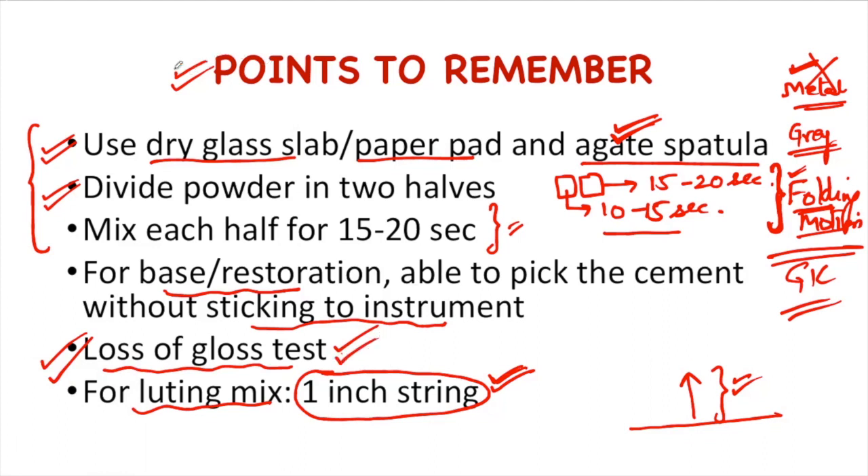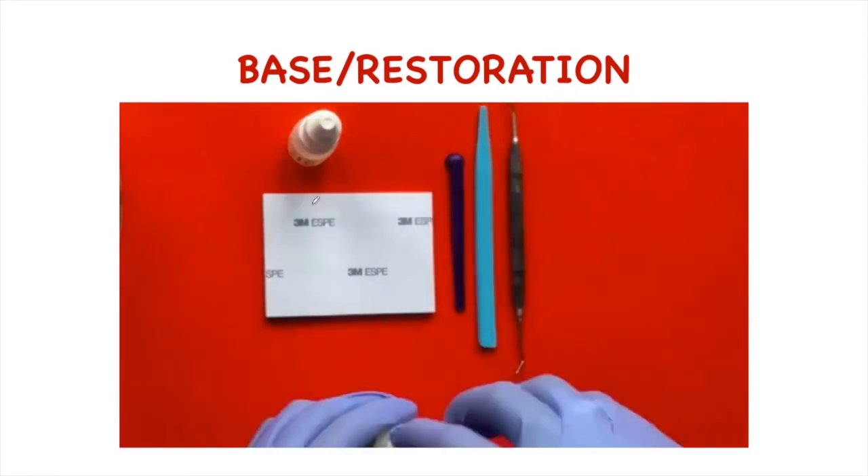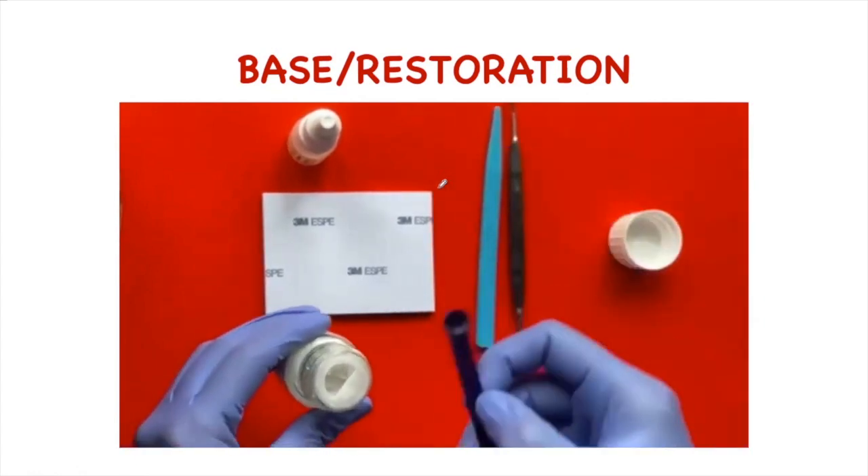Let's take a demo of the manipulation of glass ionomer cement. Looking at the armamentarium for mixing, we need the powder, liquid, paper pad, a measuring scoop, an agate spatula, and a plastic carrier.